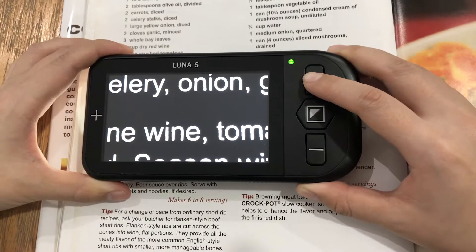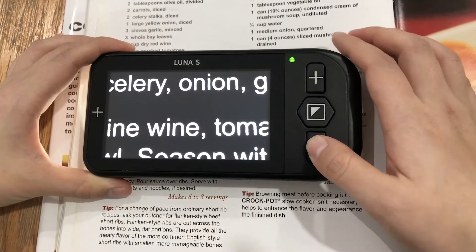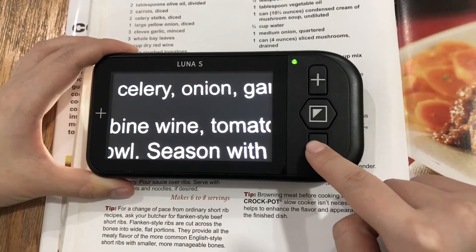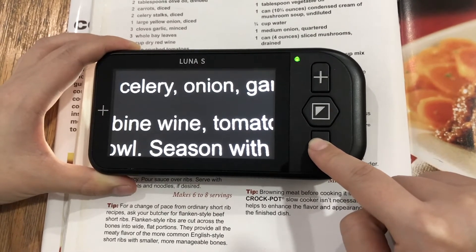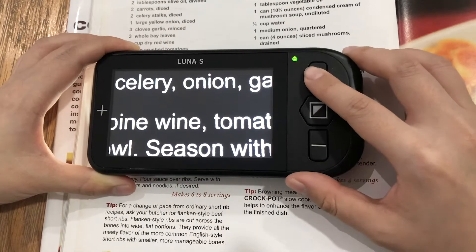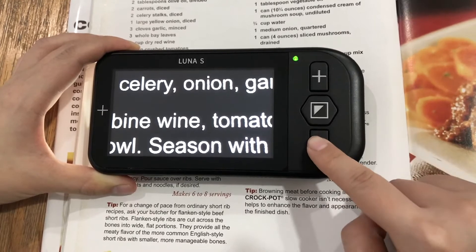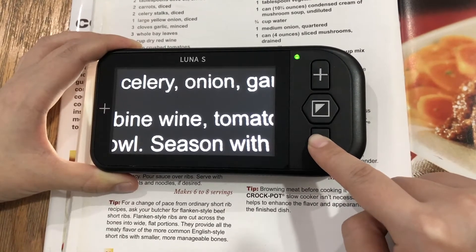Settings. By default, the button beep sound is on. To turn it off, press and hold the zoom out button for 5 seconds until you hear one beep. To turn it on, press and hold the zoom out button for 5 seconds until you hear 3 beeps.